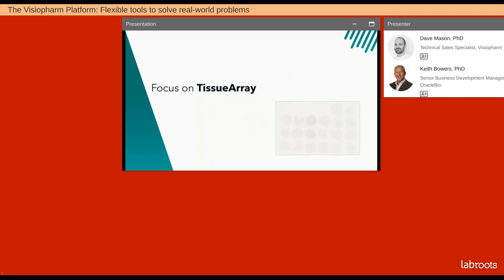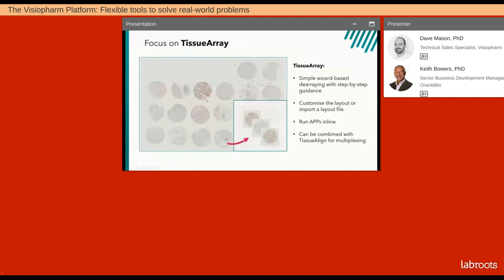I'd like to move on and talk about some of the modules available in VisioPharm. The Tissue Array module is chiefly designed to de-array TMA slides — slides that have many tens or hundreds of individual cores representing either different tissues, different patients, or different experimental types. It's a very high-density way to collect data. What the Tissue Array module can do is break up each one of these cores into individual units or images for processing.